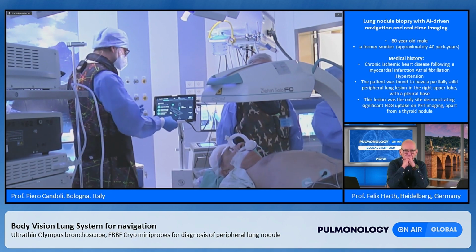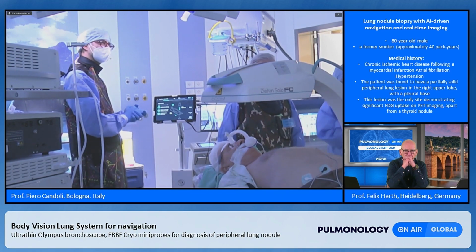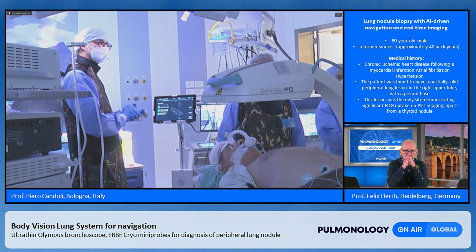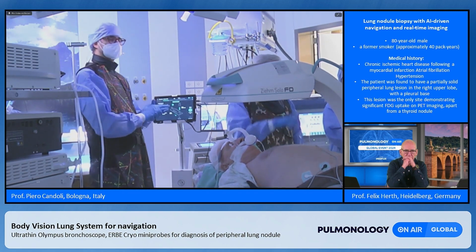Okay. Up 4 centimeters, yeah. Okay. Take a look. 2 centimeters more. 2.